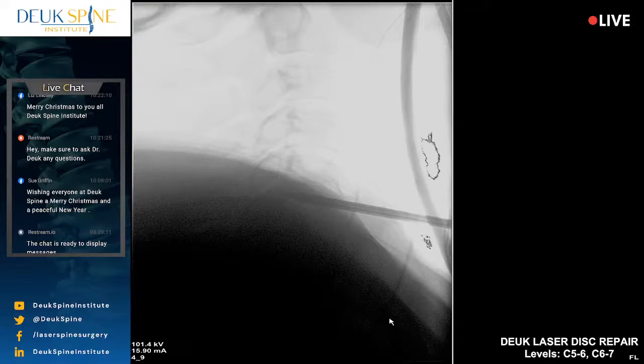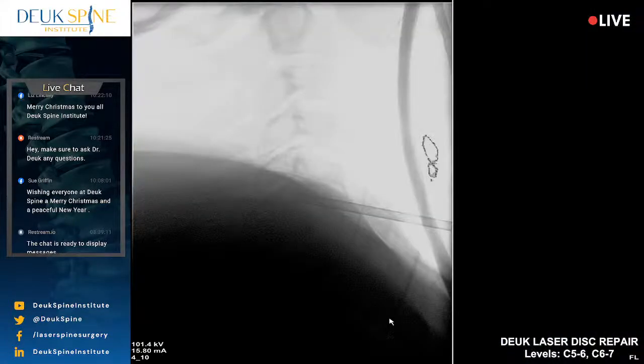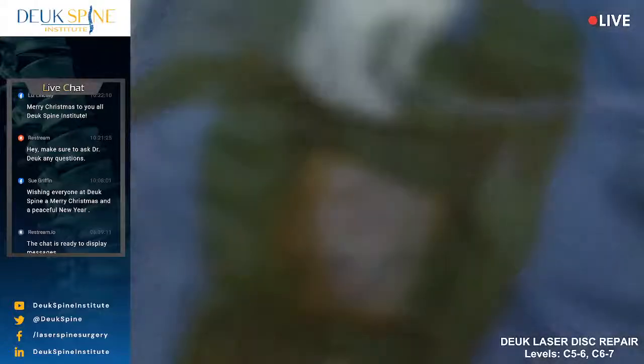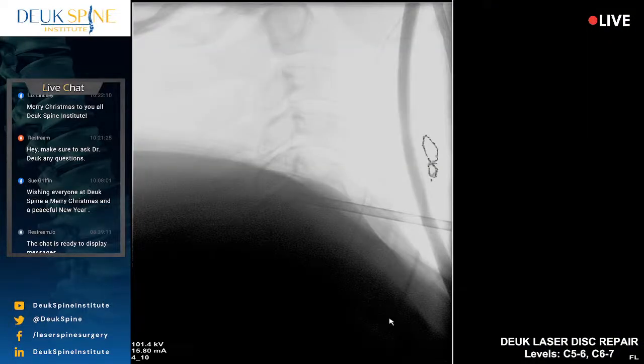We're just about done with X-ray. I just need it for another minute. Hey, I think that's pretty darn good right there. All right. So we've got our tube in the back. Take one more shot. And we're ready to rock and roll. We're right at the tear, where the tear begins. The tear is about 1 centimeter thick from front to back, but it's allowed the jelly from the nucleus to squeeze through the tear and wedge itself into the tear, causing all this neck pain and headache and arm pain.